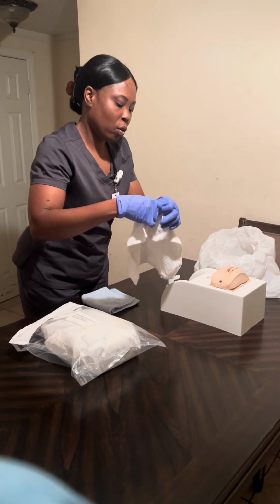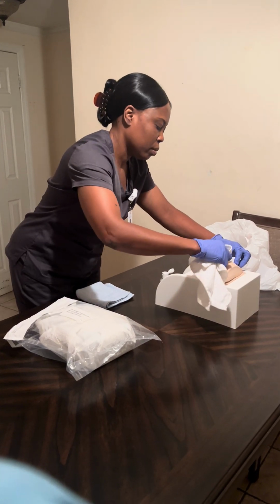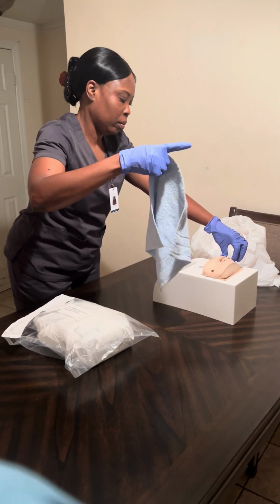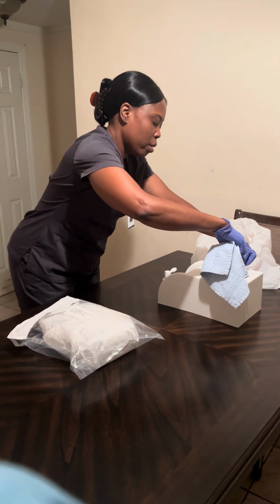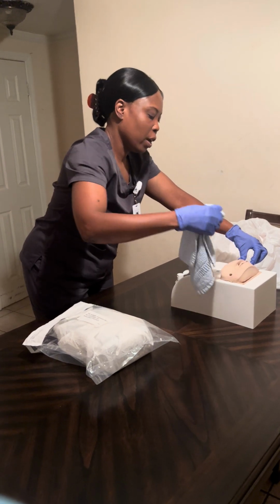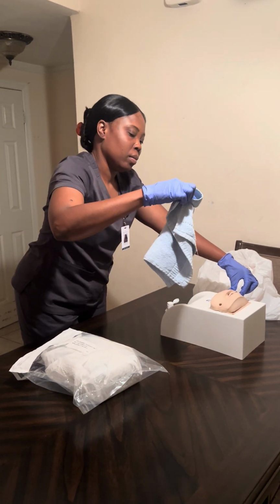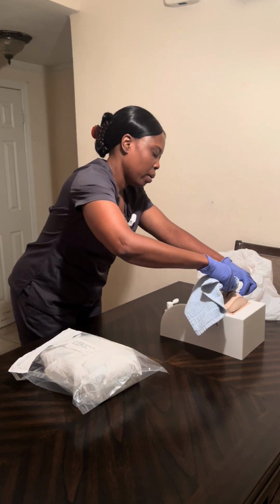I'm gonna clean the middle part now. Put in the garbage. Now I'm gonna dry. I'm gonna do the same thing from the top to the bottom, anterior and posterior. I'm gonna fold it again. Do the middle part.